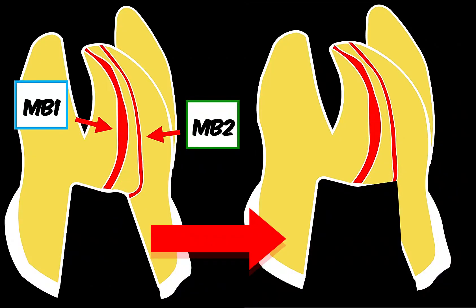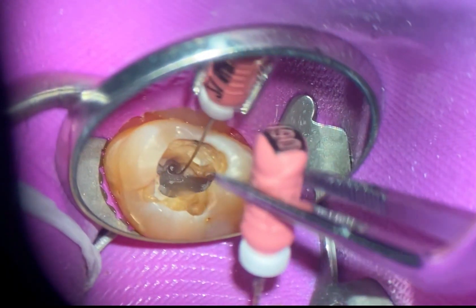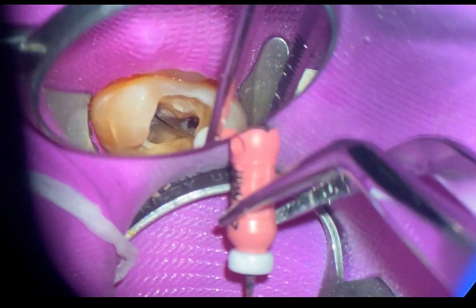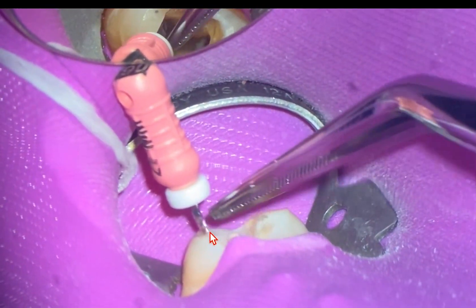You can use an endotracer, and I'm going to move that orifice mesially. The clinician was asking me what I was doing — whether I was moving it mesially — and I said yes. But in this situation, the orifice actually didn't move that much mesially. It moved a little bit and then started dropping apically, which allows us to now get our file in straight up and down. Using cotton forceps to take a number six short file, we start to watch-wind that file down to length. You can see it moves a little bit apically and a little bit mesially, but we've already got that file down to 17mm, 16mm — so we're on the right path.